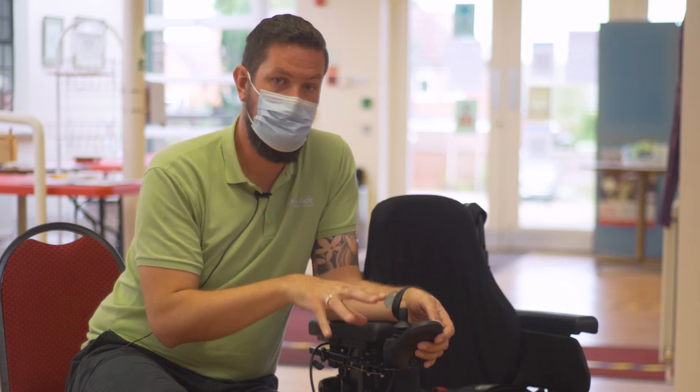Regardless of the type of remote you have on your power chair, it's really important to take note of the lights that are flashing, how many lights are flashing, and report that to customer services so we can diagnose the fault within your power chair.